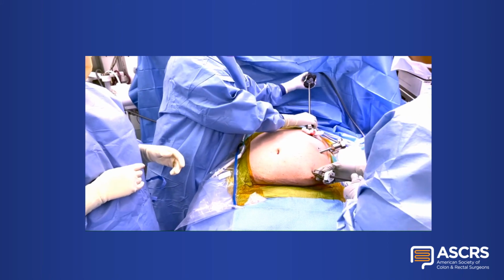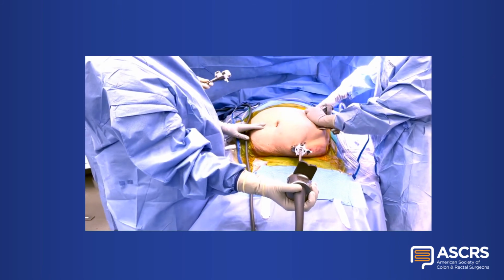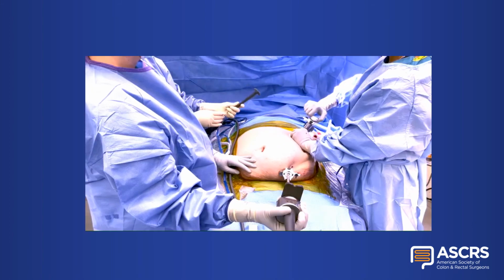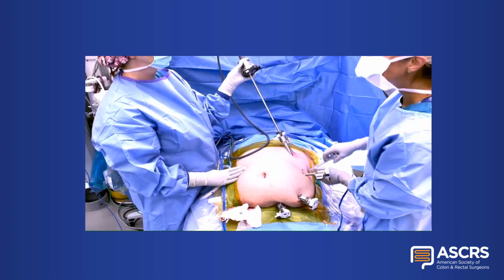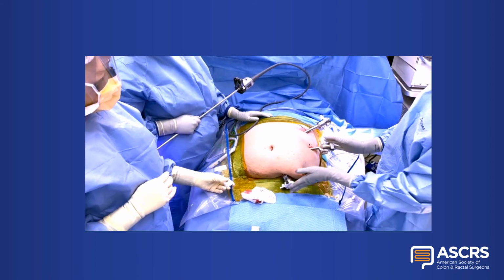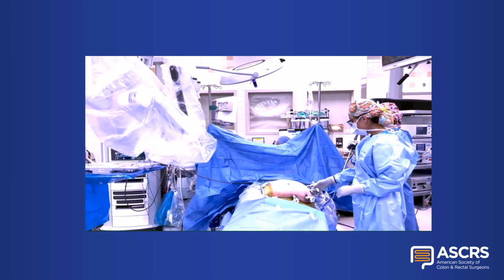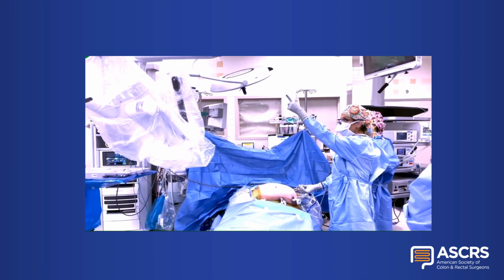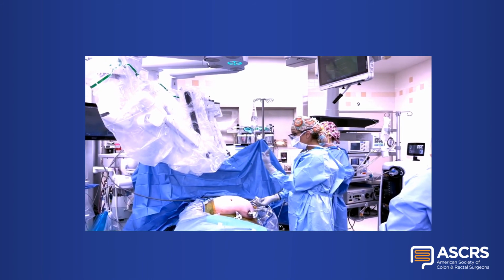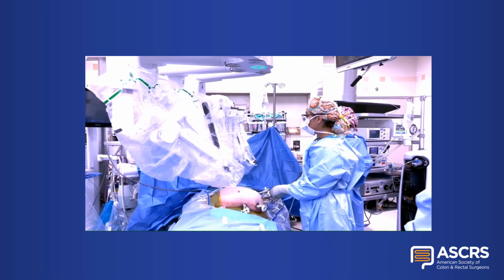We then exchange the 8 mm port for a 12 mm port to allow the use of a stapler device in the area. Then we'll place the assist port that is 7 cm away, outside from the Da Vinci ports. We now will start the process of docking the robot. The laser will guide us to place the robot at the camera side port.